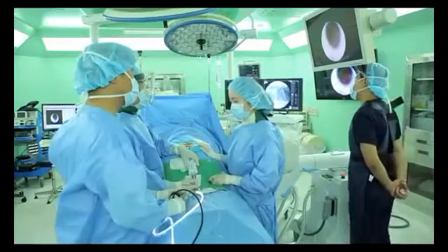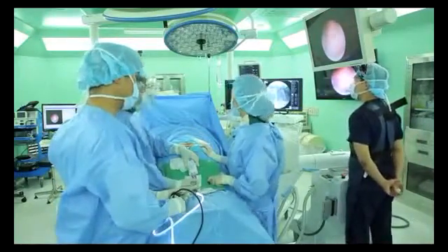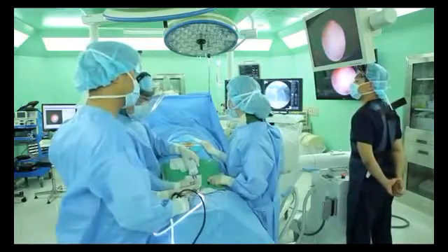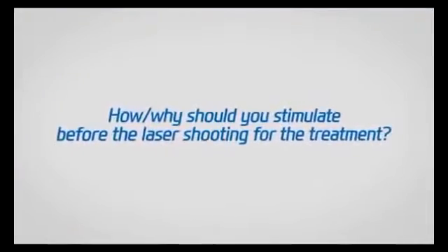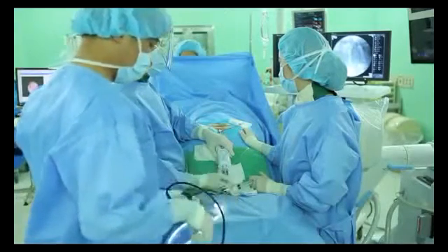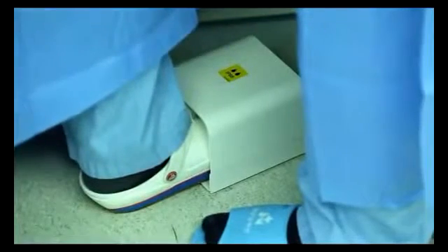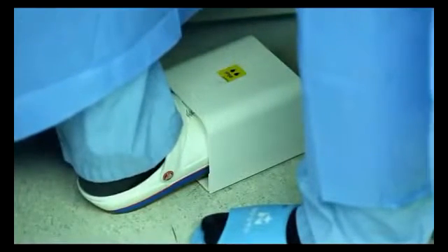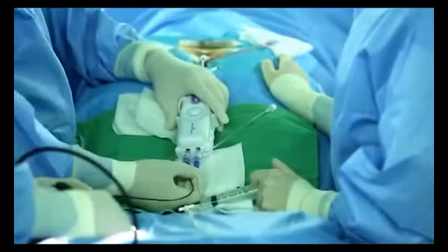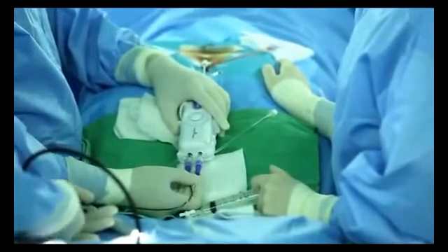Now, let's start laser treatment by seeing through the endoscopic cable. It's the key point of this SELD procedure. Laser treatment is composed of stimulating or testing and shooting or firing. Explain stimulation first. The stimulation is required to make sure of firing the laser safely. Especially for the new doctor for SELD, safety is the most important point.